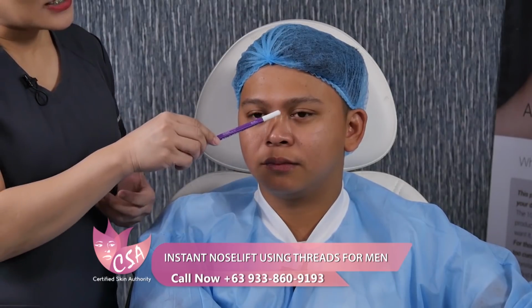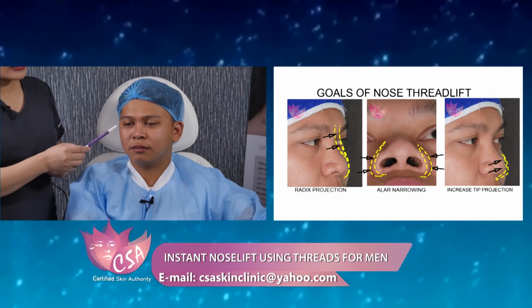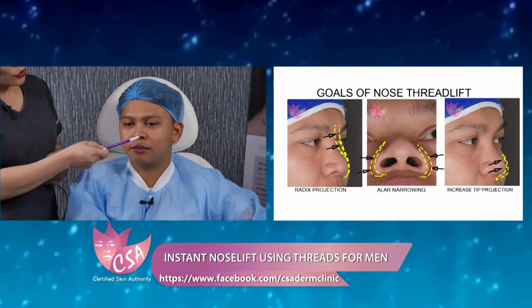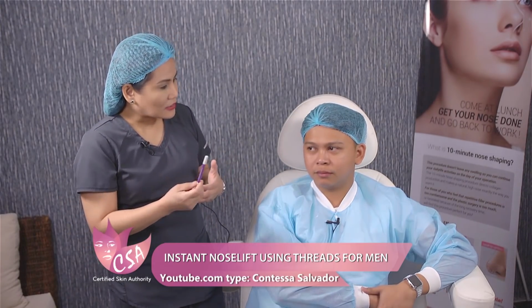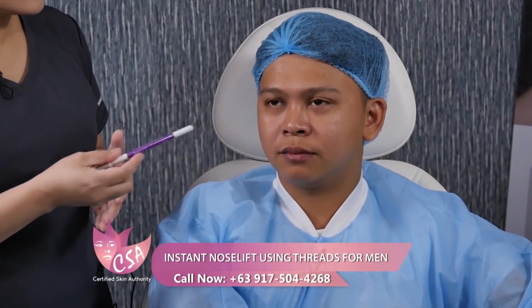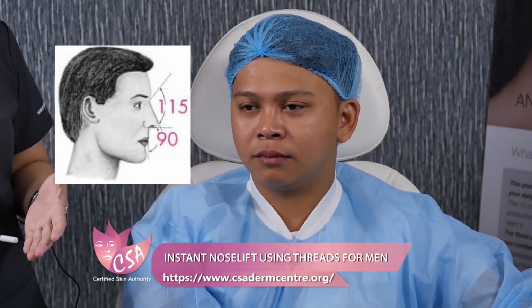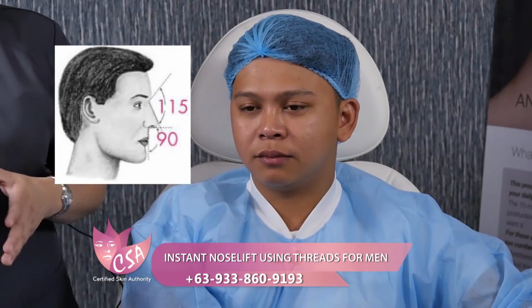Ang goal natin is increase this radix projection here and also project yung kanyang nasal tip so we can still project it forward anteriorly. So, pwede pa natin siyang i-elevate tong part na to. And then, following yung ating mga measurements, yung mga angles, so sabi natin, we have the nasofrontal angle around 110 to 130 degrees. And then going here, the nasolabial angle. For men, we prefer the 90 degrees to about 95 or even 100 degrees. So kay Neil, we can still have this better nasolabial angle.